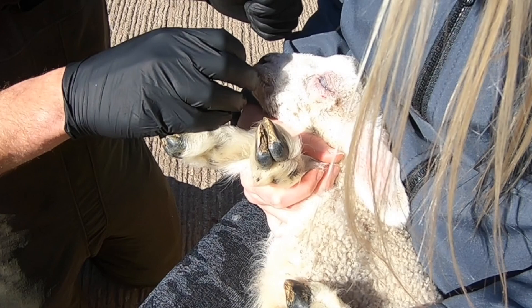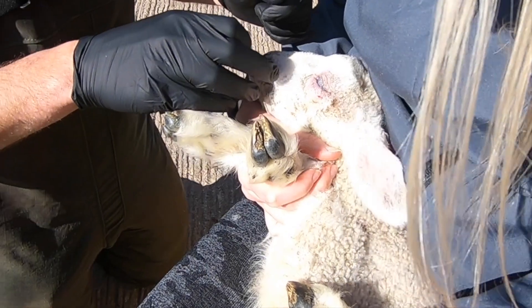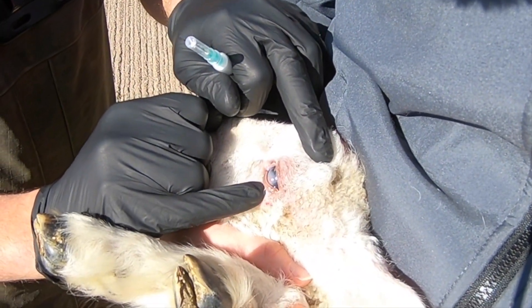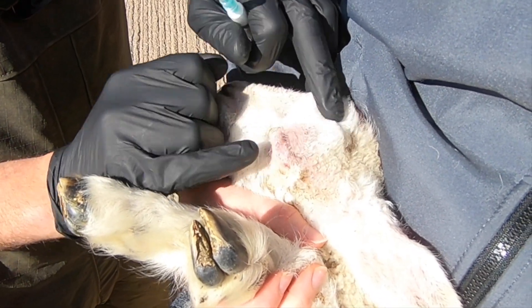This is a great example of when using the right size needle and syringe makes the job easier. Use a syringe of maximum two and a half mils — you don't want to be wielding a big 10 mil syringe when only injecting half a mil to a mil. Use a nice fine needle; here I'm using a half-inch 21 gauge needle, not the heavy-duty needles used for sick or lame ewes. A fine needle reduces resistance from the lamb, making it easier to get this right first time.